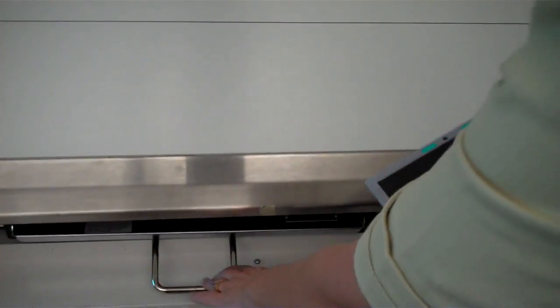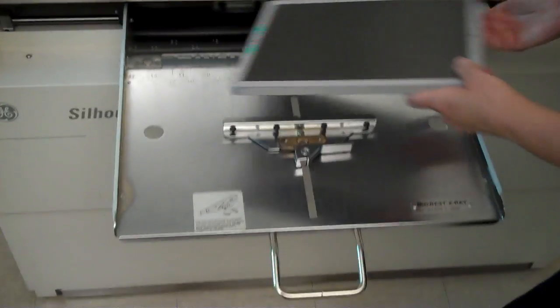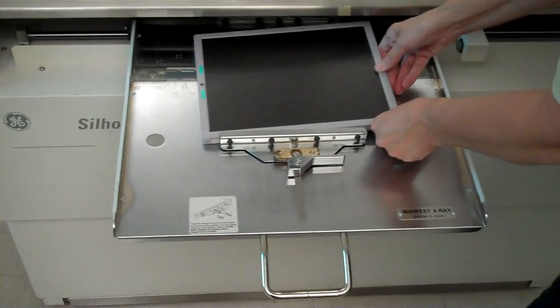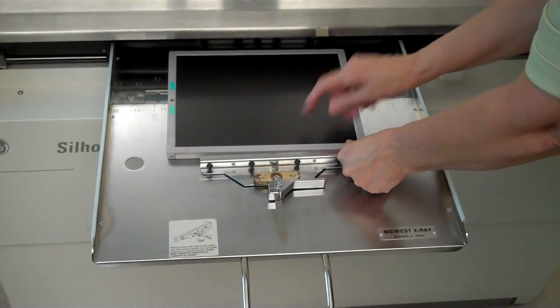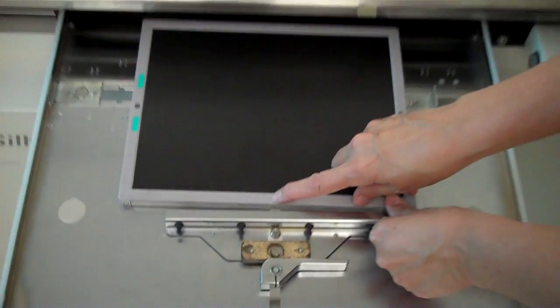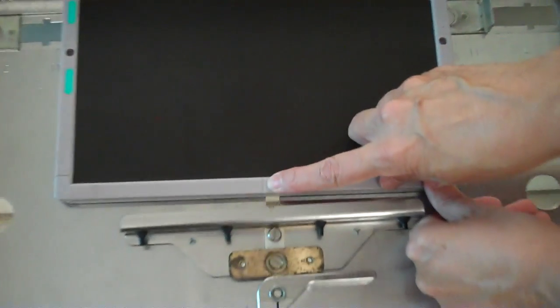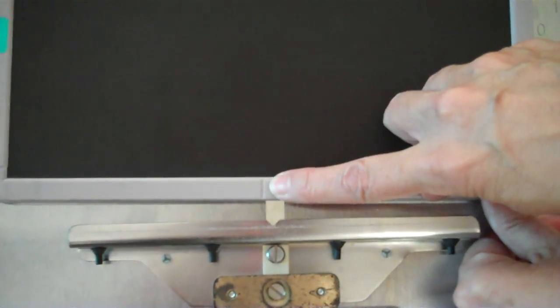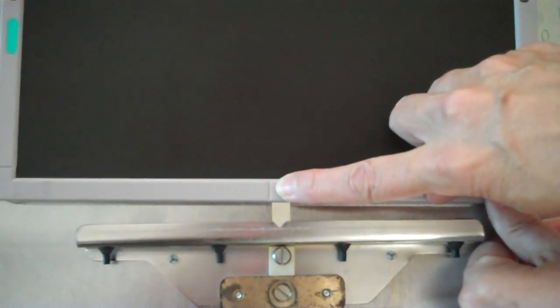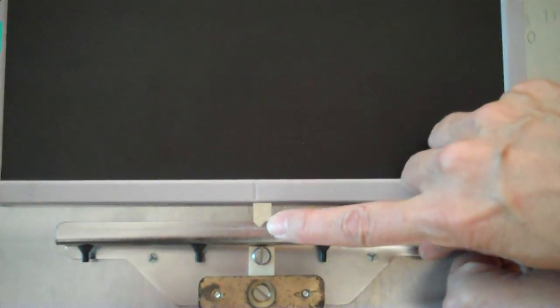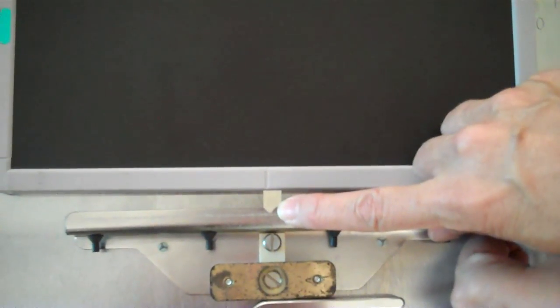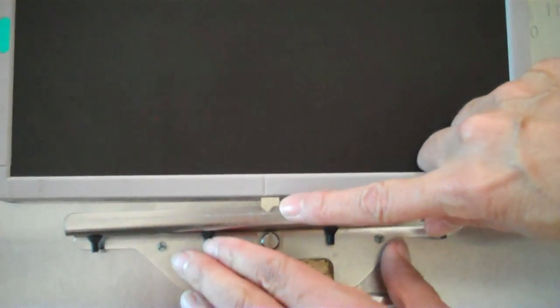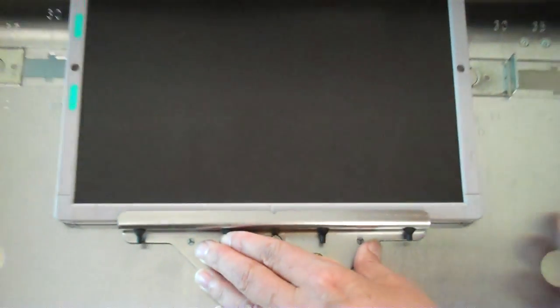Now we'll take the image receptor and replace it in the table bucky. You'll notice on the image receptor, there's a line which marks the center of the image receptor. And we'll use the line on the bucky tray to make sure that we're in alignment.